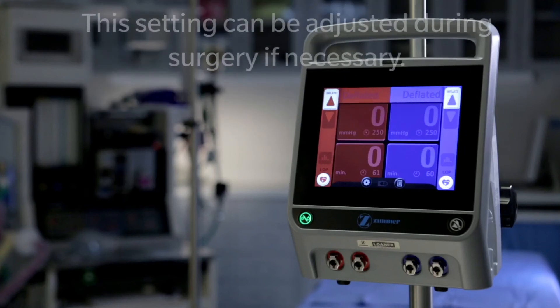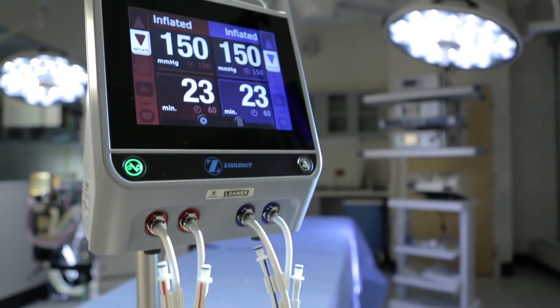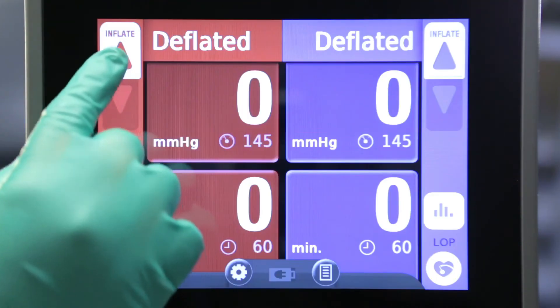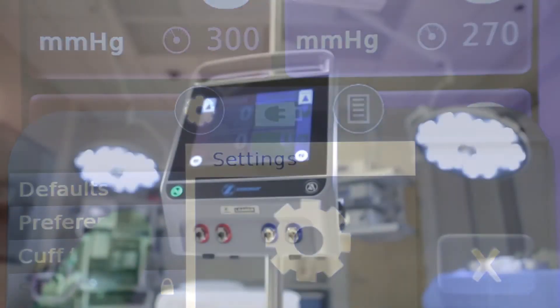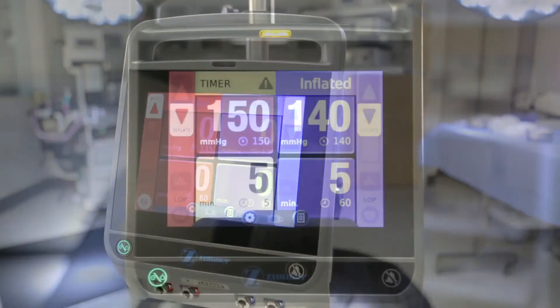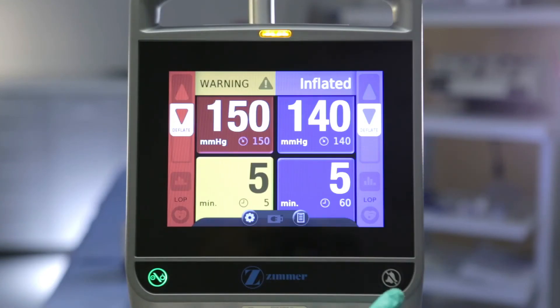Now that we have covered all of the preoperative settings, it's time to learn about inflating and deflating the tourniquet for surgery. To inflate the tourniquet, simply tap the inflate button corresponding to the cuff you wish to inflate. While the tourniquet cuff is inflated, pressure, time, and preferences can be adjusted if needed. The ATS 4000 recognizes two types of errors. For a minor error, such as time expiring, the indicator light will flash yellow and a message will appear on the screen. This type of error can be silenced for 30 seconds by pressing the alarm silence button.